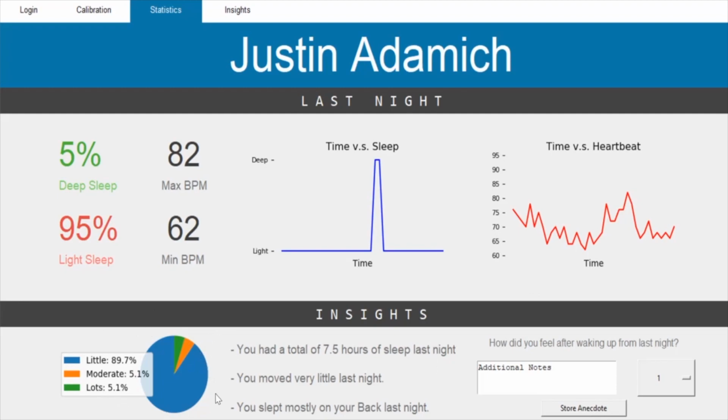So this is a chart of how much movement you had while you were sleeping. For this person, 90% of the time there was little movement or no movement, and only 5% of the time they were moving a lot. It will tell you the total number of hours of sleep, and also whether you slept mostly on your back, on your left side, or your right side.